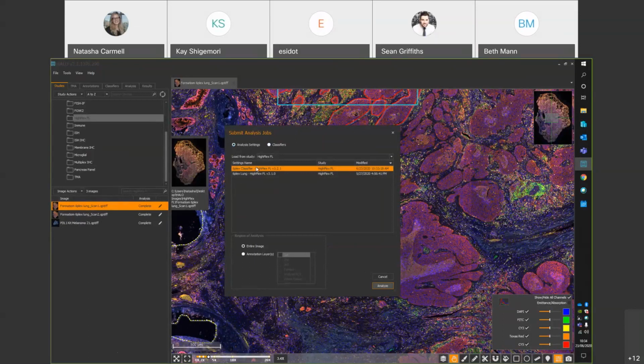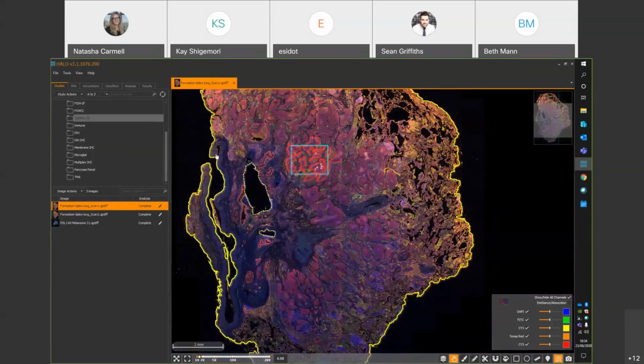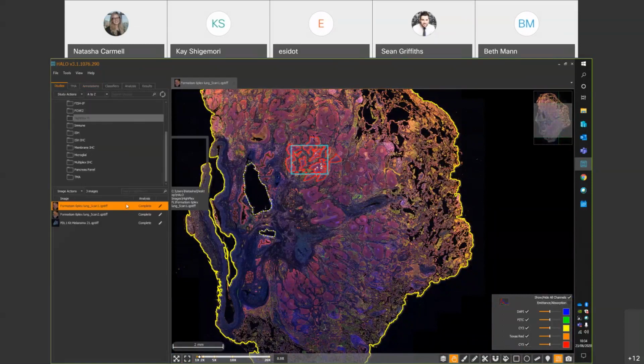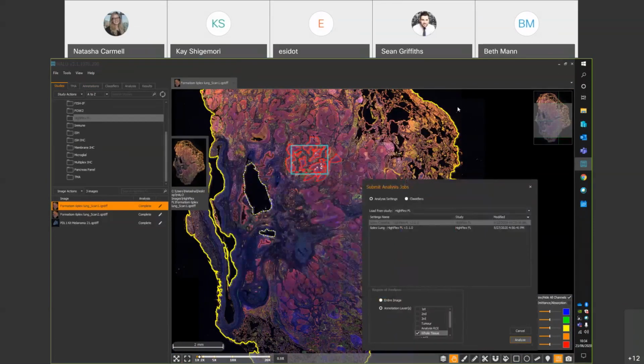one analysis job essentially. I'm just going to check what annotation layer my yellow one is to speed up the analysis. So it's labelled as whole tissue, which is helpful. So the reason I'm analysing the annotation layer is we've got plenty of black space around our tissue. So analysing our annotation layer will just kind of focus the analysis within the region of interest and save time.